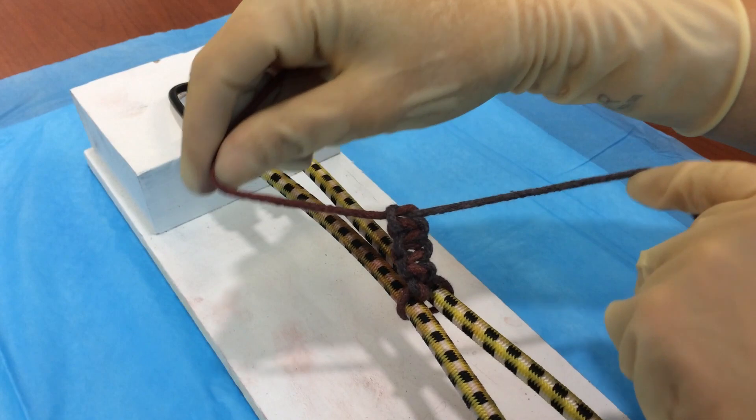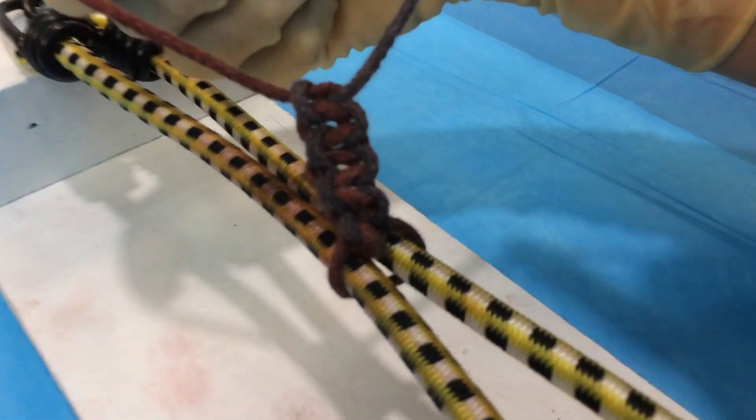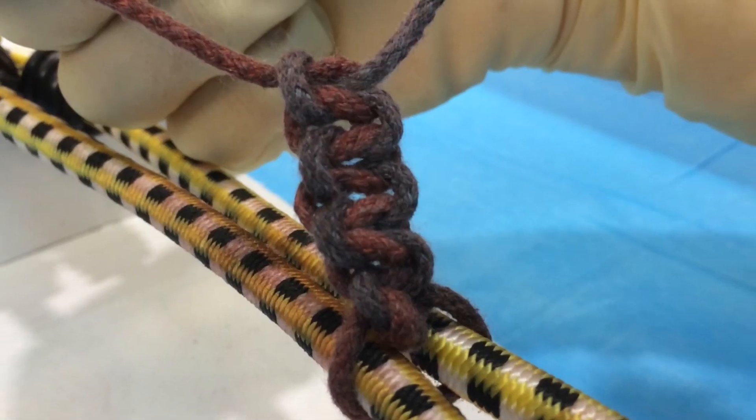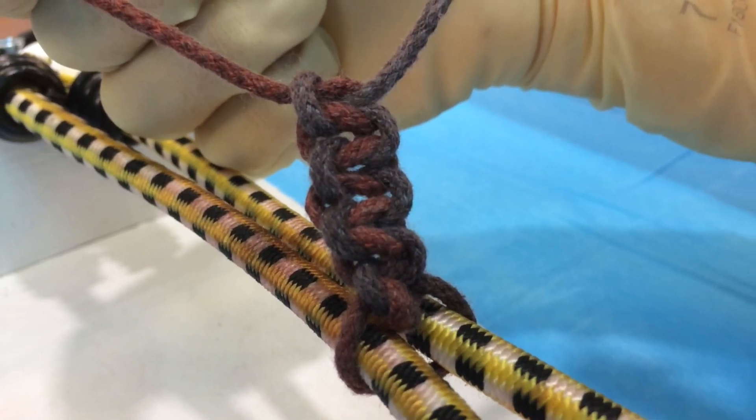In order to check ourselves in this tying model, we'll zoom in on the knot and take a look. When properly tied, you should see a nice, even braid created. And that's how you tie a surgeon's knot.